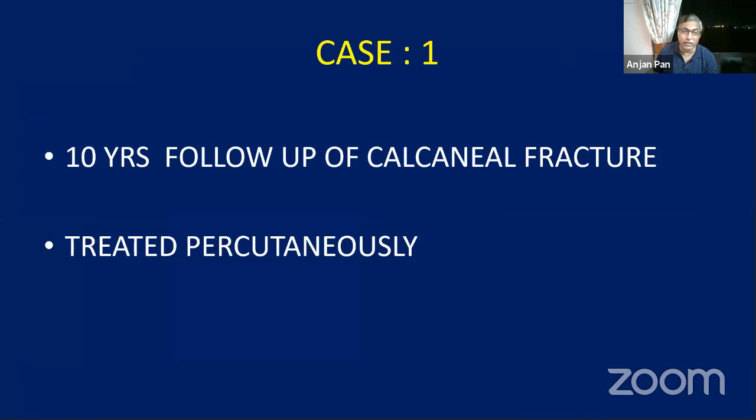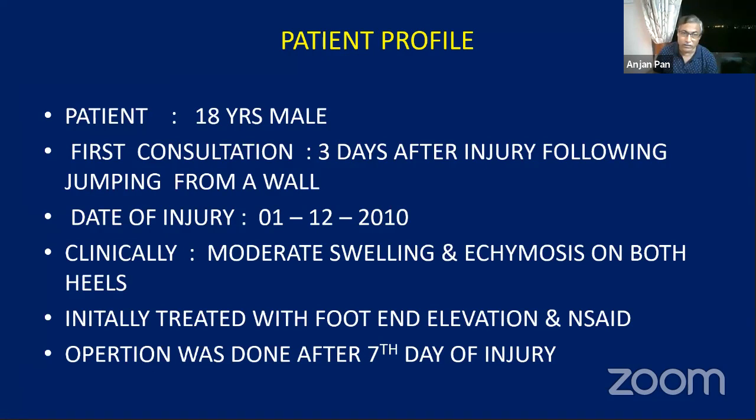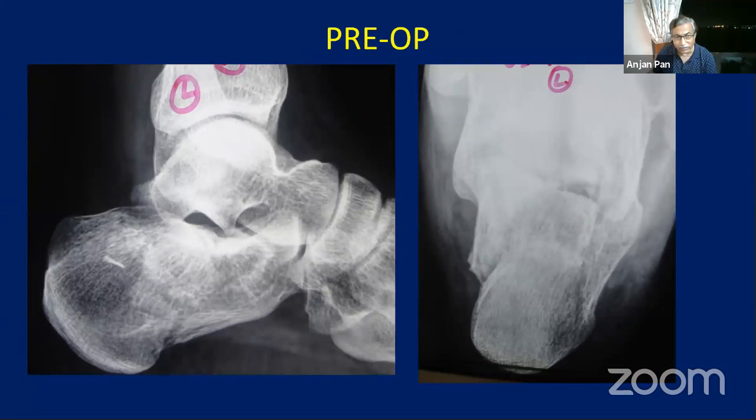This is case 1. It is a 10 years follow-up for calcaneal fracture treated percutaneously. Patient profile is an 18 years male. He came to me for first consultation 3 days after injury following jumping from a wall, and the date of injury is 1st December 2010. Clinically, there is moderate swelling and ecchymosis on both heels. Initially treated with foot elevation and NSAID. Operation was done after the 7th day of the injury.